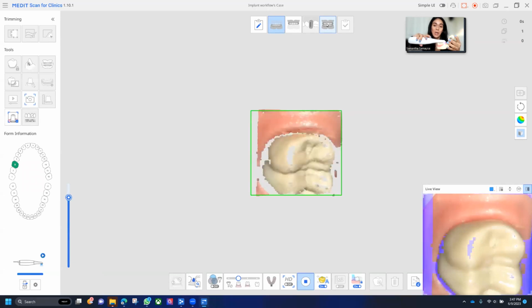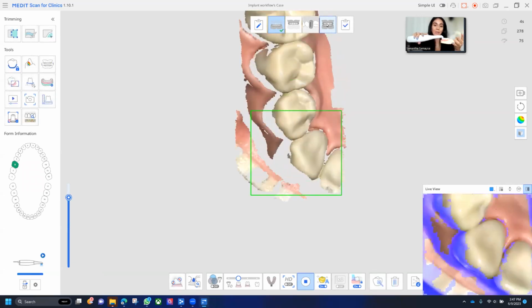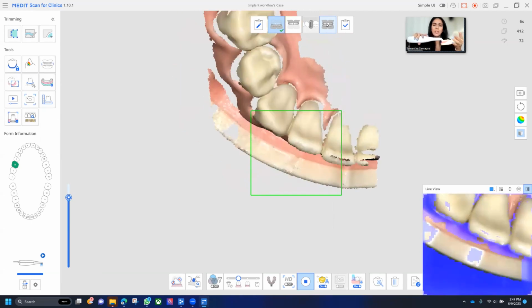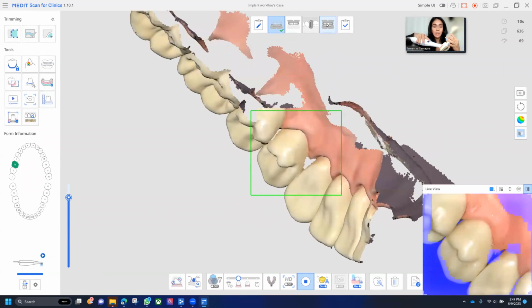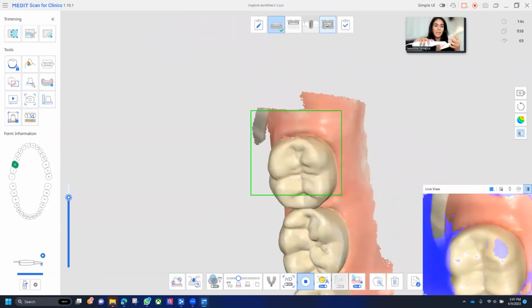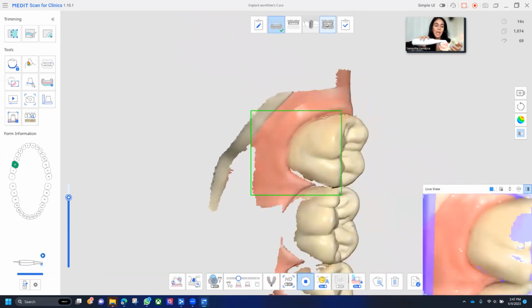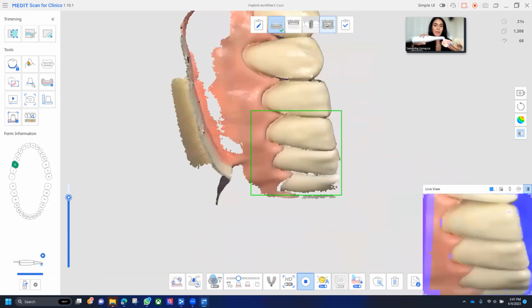And one push will activate that occlusal scan. I'm going to do a little wiggle. Because we're only doing a single tooth, I'm going to only focus on doing a quadrant. And we're going to go ahead and work our way to the buccal. Occlusal, and now buccal. Perfect.